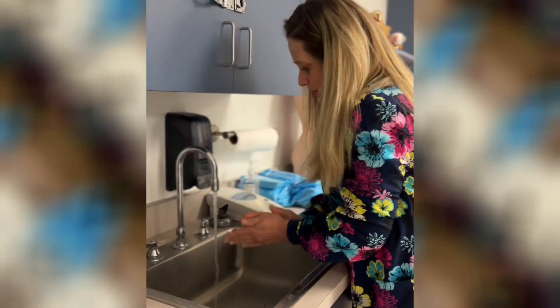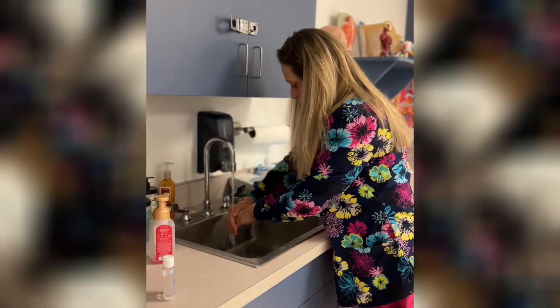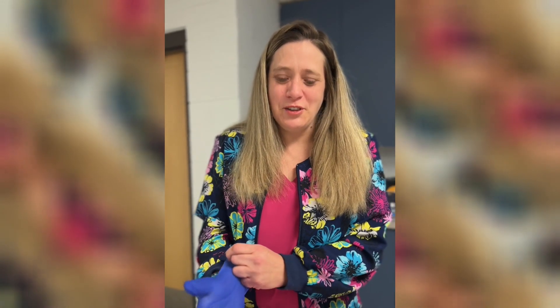Hi, my name is Carrie, a student at West Virginia Junior College in the medical assisting program. Today I'm going to demonstrate the proper way to put on and take off gloves. First, you have to wash your hands and make sure they're clean and dry.